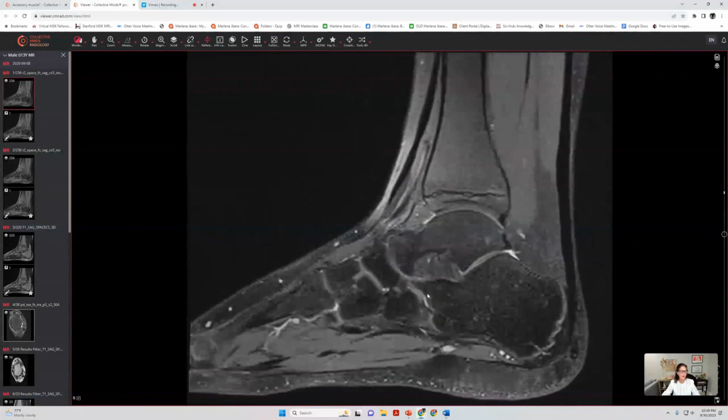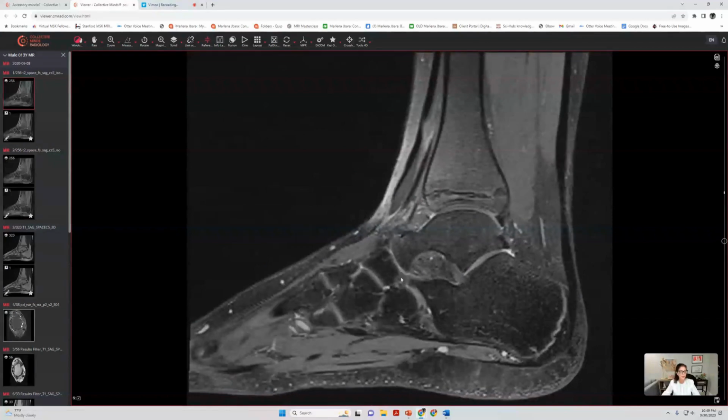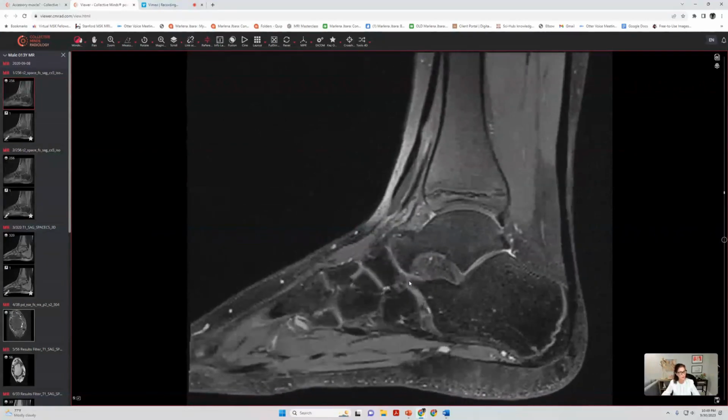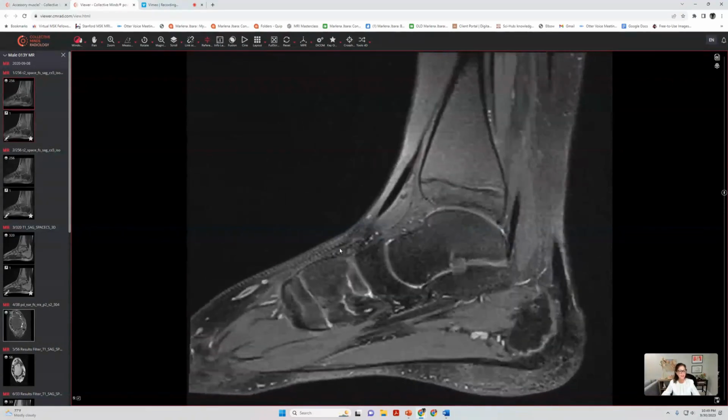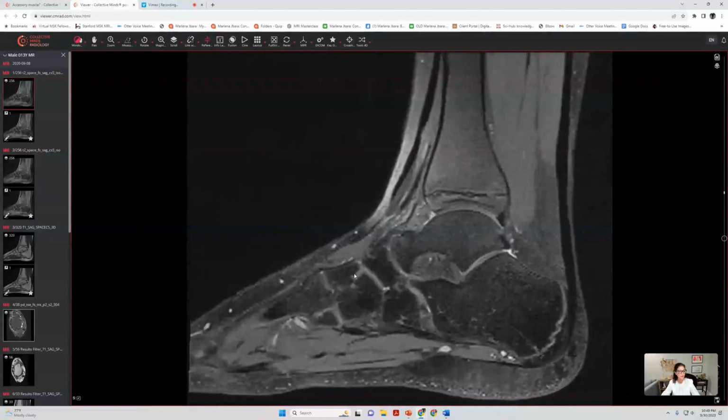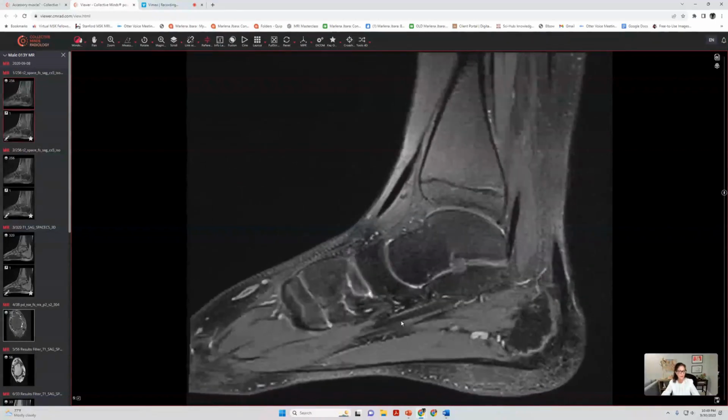We can furthermore look at the region of the calcaneonavicular articulation to assess whether or not there is a coalition in this location. And we can assess the bony structures of the midfoot, whether or not there are any dorsal subluxations or fractures or any kind of pathology there.